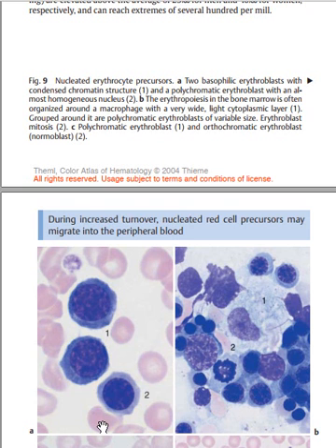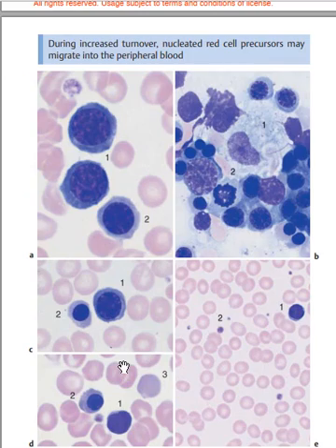Then you have the basophilic erythroblast. The polychromic erythroblast is produced when the color of the cytoplasm is both pinkish and bluish, as you can see here. So the first is the pro-erythroblast, the second is the basophilic erythroblast. Sorry, it's not orthochromic, it's basophilic erythroblast. The third is the polychromic erythroblast, and then the fourth is the orthochromic erythroblast, when the cytoplasm is becoming more pinkish, as we've seen in the last diagram.